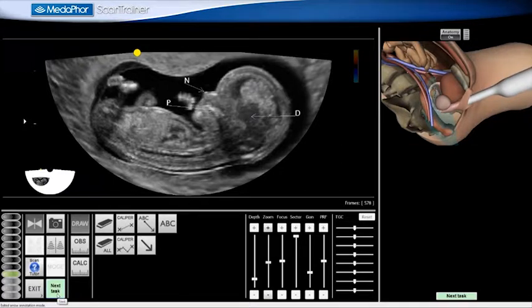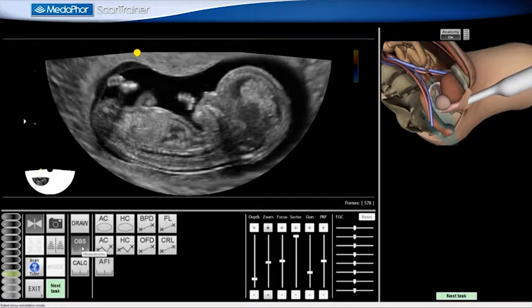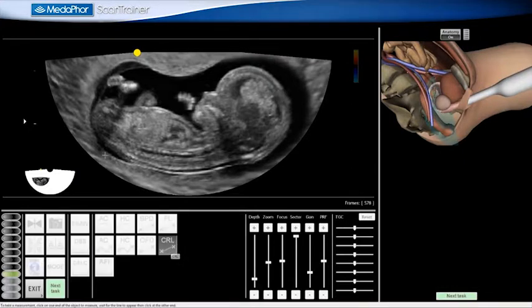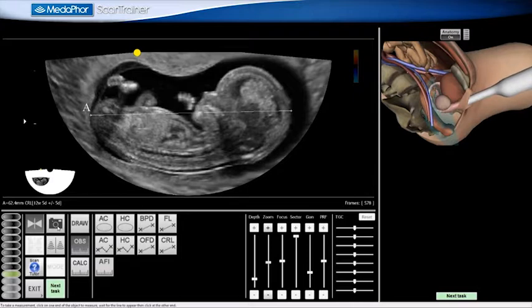I will now measure the Crown Rump Length. As there is insufficient space for my new annotations, I press the delete all button to remove my previous annotations. I then open the obstetric measurement submenu, click on the CRL button, and measure the Crown Rump Length. I capture my image and click Next.